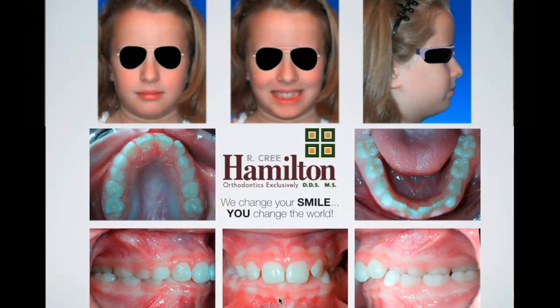So when we break this down, so we can look at the incisors, right? We have the front 4 incisors here, all right? So would you agree that most of the crowding in the upper arch is currently manifesting itself in the incisors region? Is that a fair statement? Okay, yeah. So when you look back here, you have basically from canine to second primary molar, you haven't lost any teeth, and there's not crowding of those teeth per se. And typically, if you have canine, first molar, second molar, there's enough space for the permanent 3 teeth that will replace those, the 2 premolars, assuming that you don't lose that space, okay? And then on the lower, we have a similar situation, right? We have canine to second molar on both sides. We haven't lost any. And we have a mild amount of crowding in the front.